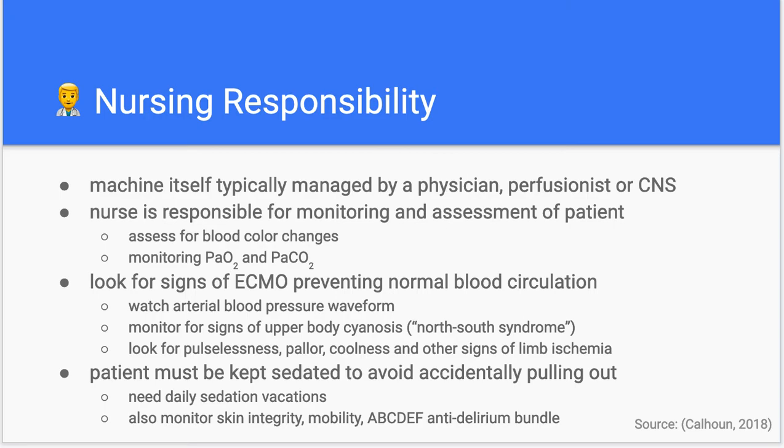And then the other big thing, as with all critical care patients, is making sure we're looking at their skin integrity, trying to do limited mobility without kinking any of the cannulas, and then just doing the standard anti-delirium bundle if patients are going to be sedated for a while on this, making sure that they're not having these other kind of issues that we typically associate with time spent in the intensive care unit.